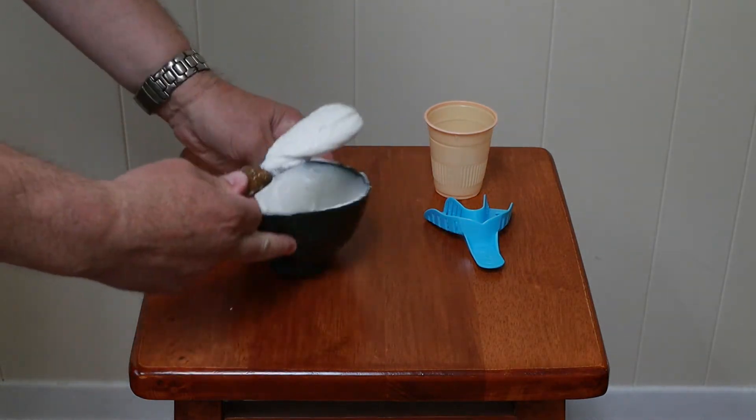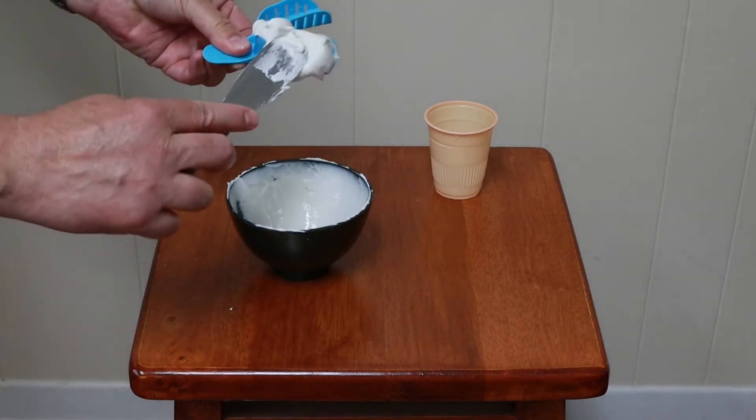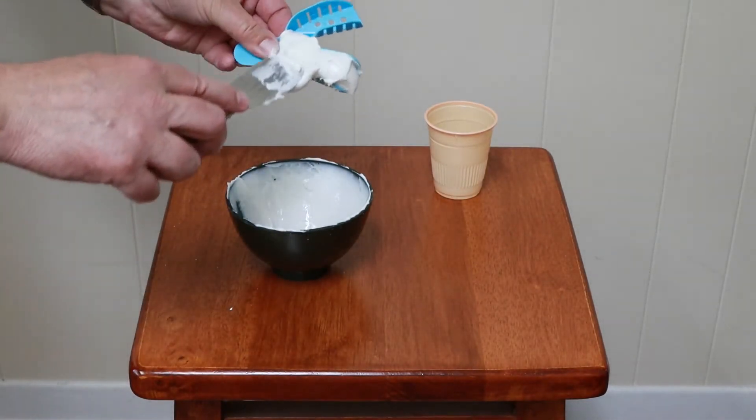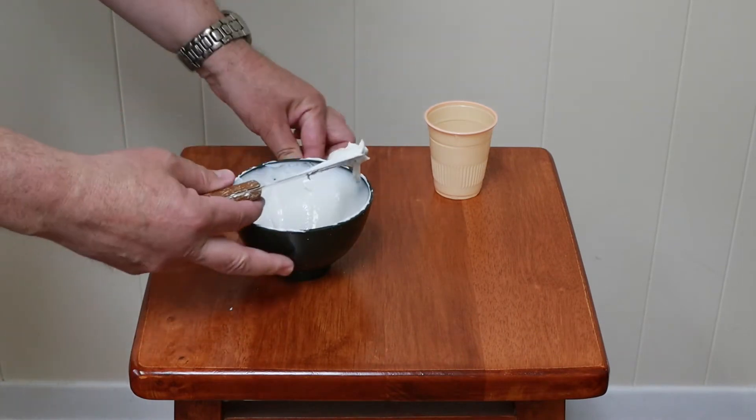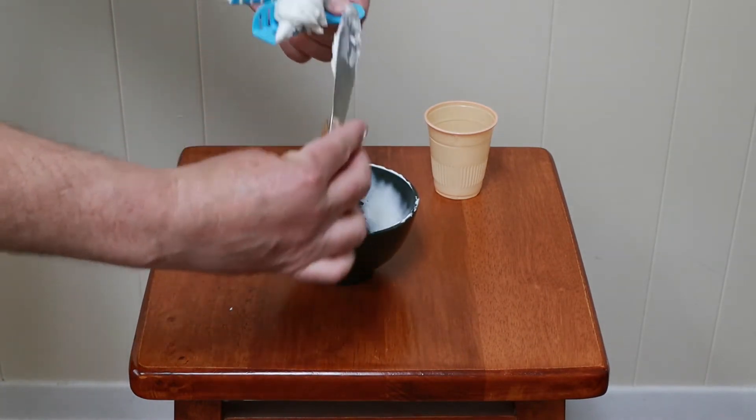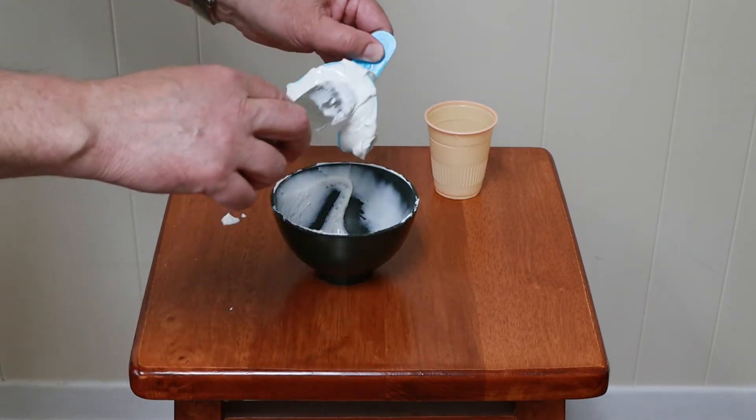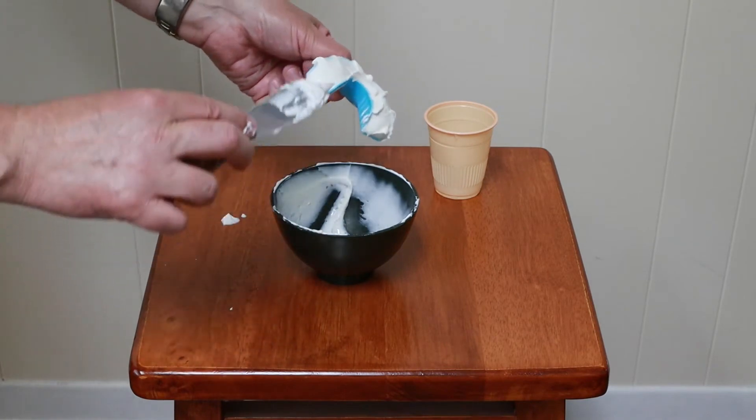load it up on the spatula, and place it in the tray. You don't want to overfill the tray. You want to fill it up just so that the tray is full, but you don't want to go too crazy, because if you sized your tray properly, that's all you're going to need is what's in the tray.